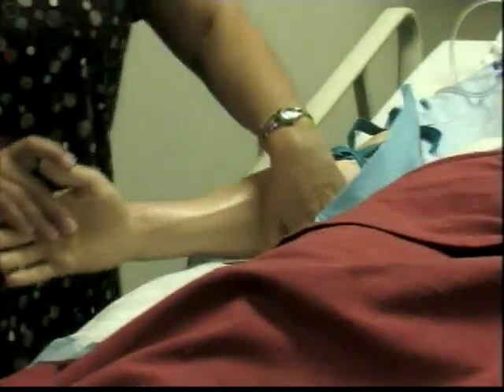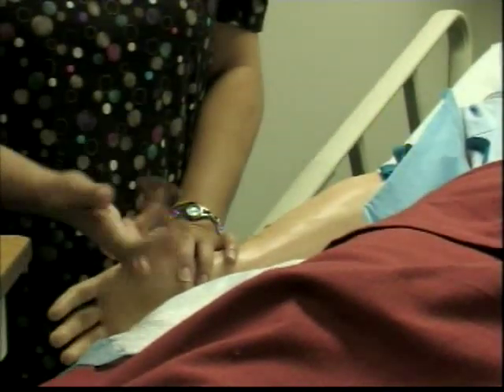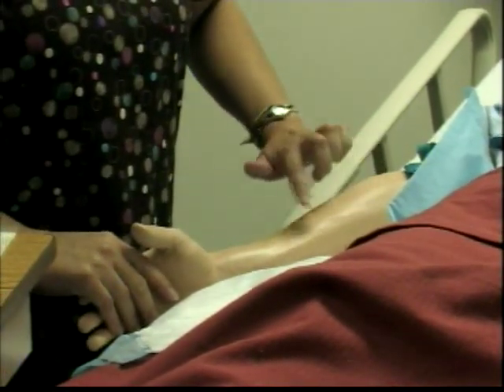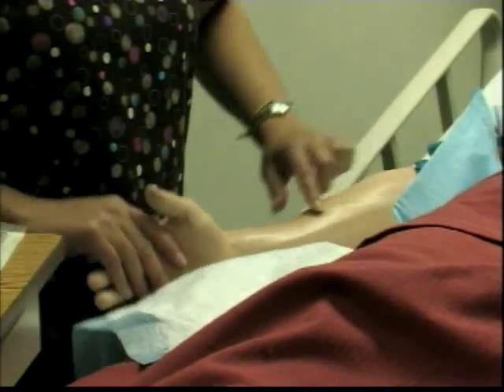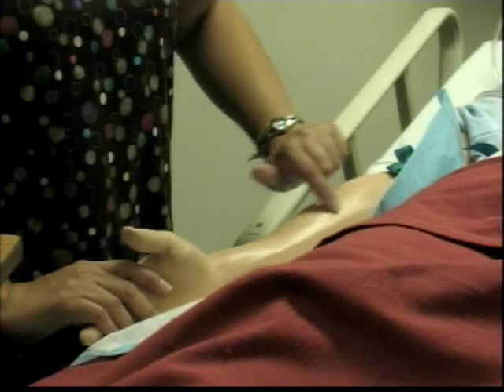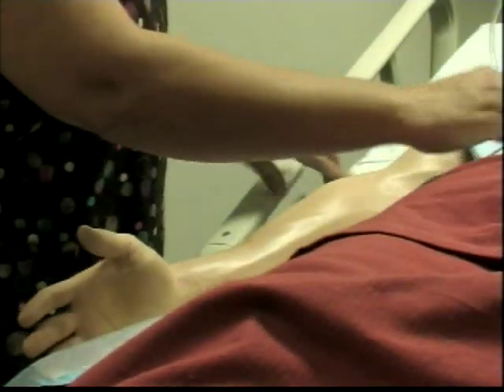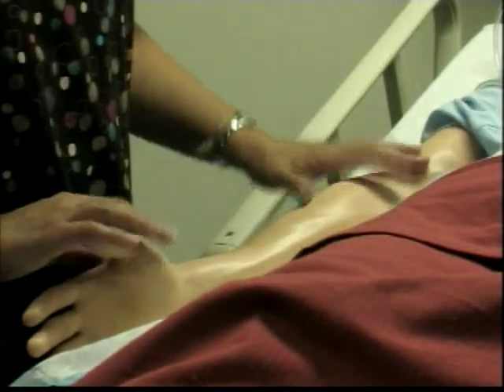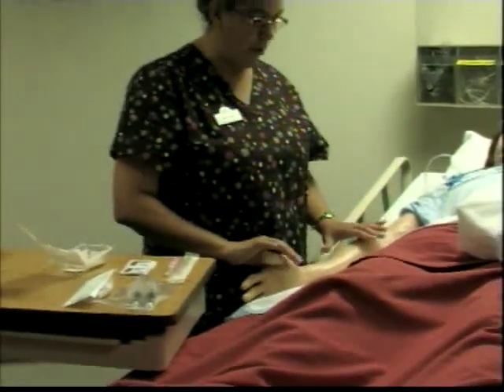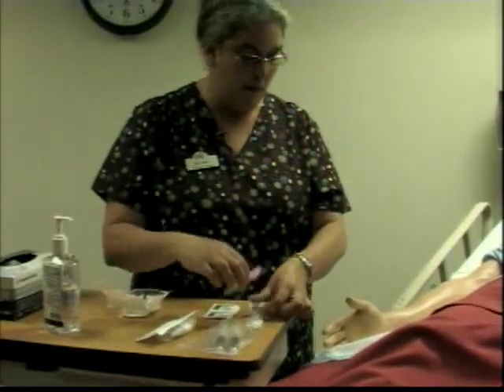There are different ways to do so. You can dangle the arm a little bit and allow the circulation to come down. You can ask your client to pump their fist, opening and closing, or you can softly palpate the vein so it'll fill. So now I have chosen this vein in this area here to perform the venipuncture. Now I will release my tourniquet and leave it in place so I have it accessible, and I will tell the patient I'm going to get all my things together and I'll come back to the arm. So I'm going to make sure that I have everything ready for me.